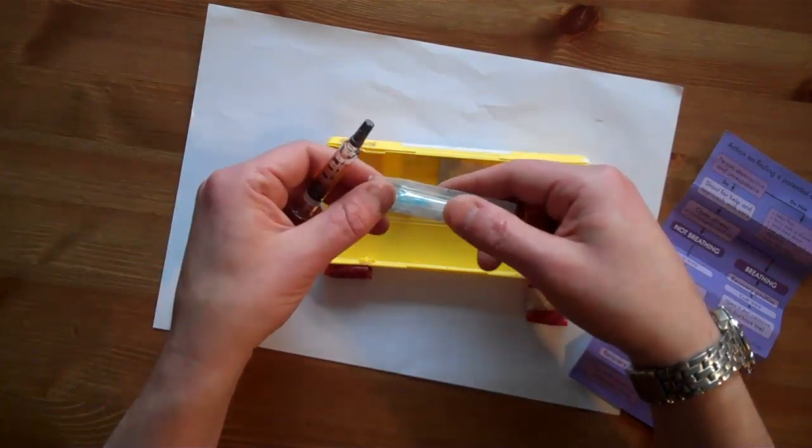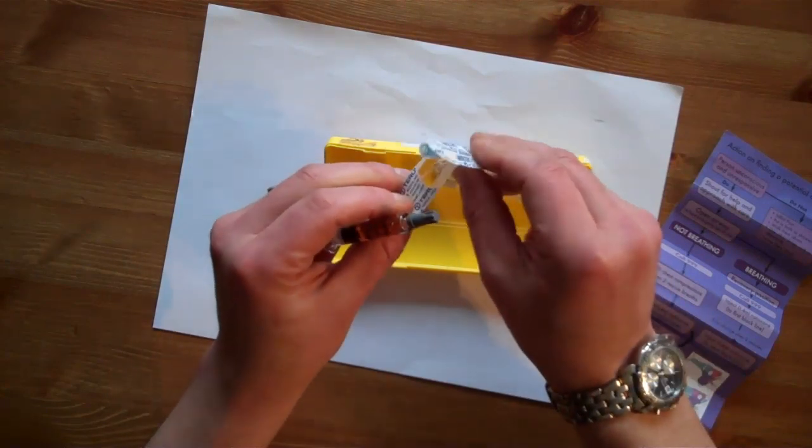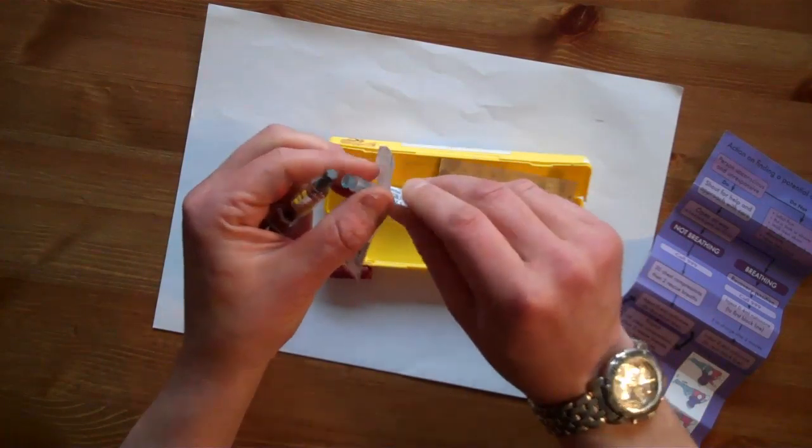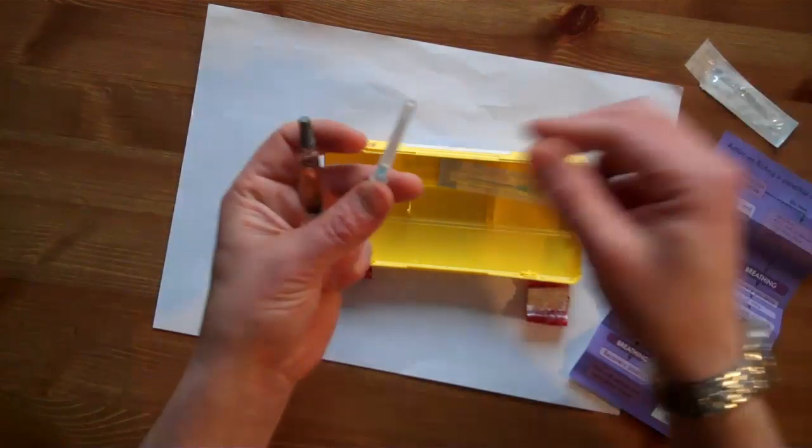First, we push through the paper end of the muscle needle packet and take out the still sheathed muscle needle.